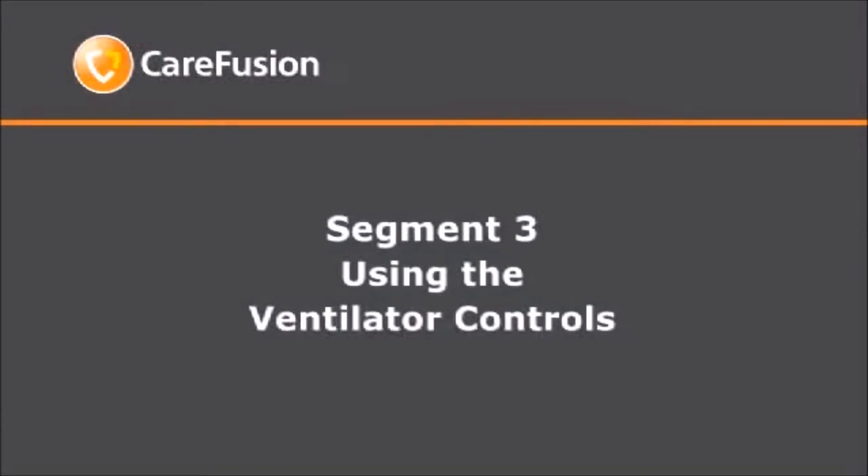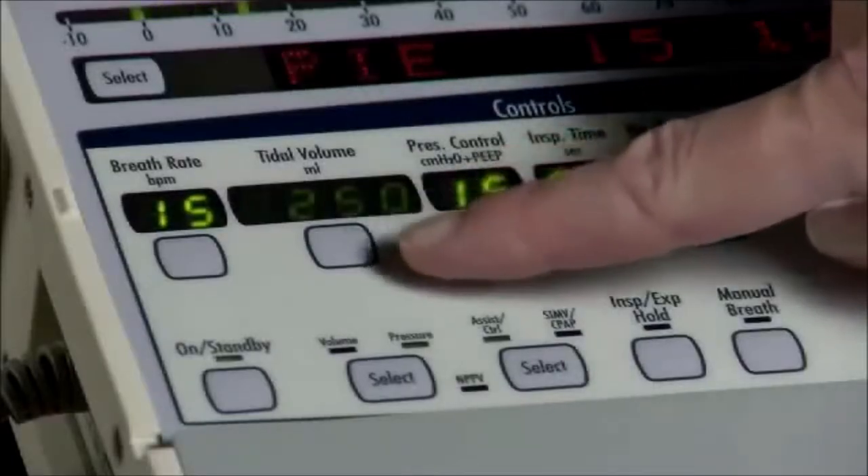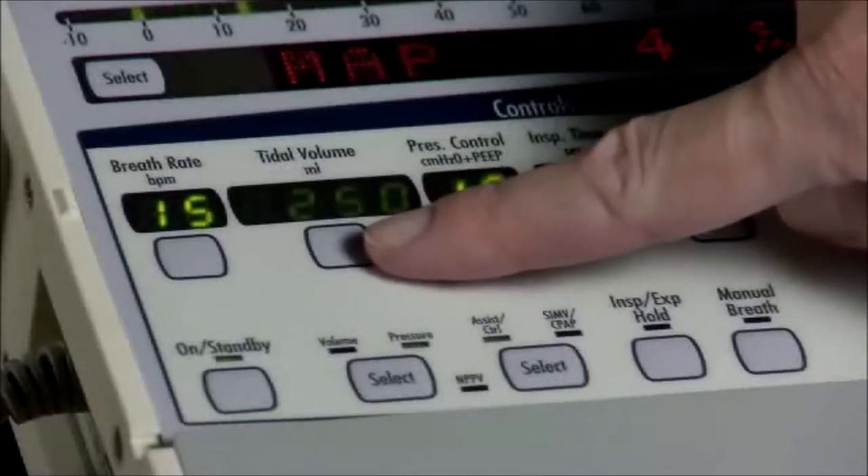This segment talks about the controls that you may have to use when caring for a patient on the LTV 1150 ventilator. Let's take a look at the LTV ventilator front panel. The control displays on the LTV 1150 can be either bright or dim. The control display is bright when it is active or when selected for change. A control display is dim when another control is selected for changing and when it is not active in the current mode. For example, when pressure ventilation is selected, the volume control display is dim. The displays may all go blank when operating on the internal battery in order to conserve power. You can turn the display back on by pressing any button or by turning the set value knob.